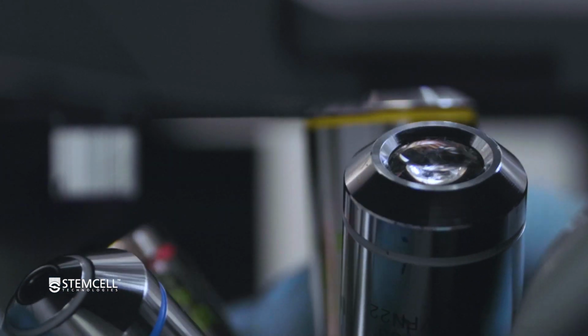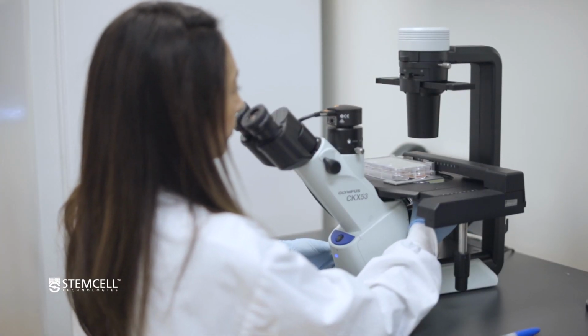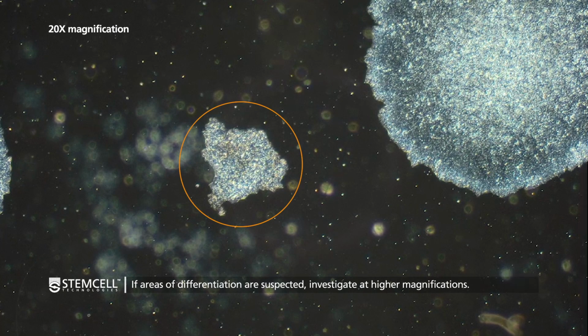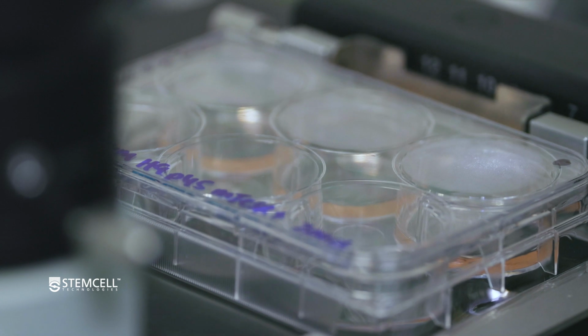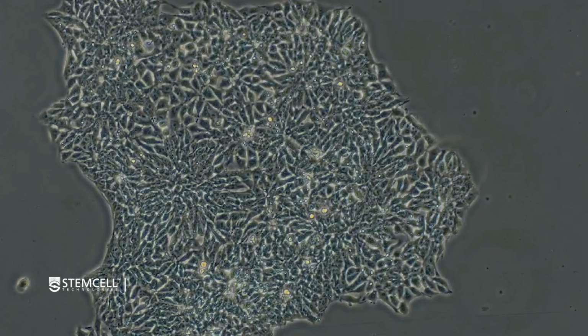When passaging using GCDR, you will need to assess the morphology as described above. At low magnification, if there are suspected areas of differentiation, in that there is a loss of border integrity, cellular packing appears more loose and disorganized, or if there are visible holes or areas of non-uniformity within a colony, investigate by moving to a higher magnification. At a higher magnification, it should become obvious if the colony contains differentiated cells. These cells will typically appear larger and less tightly packed than healthy cells in a colony.